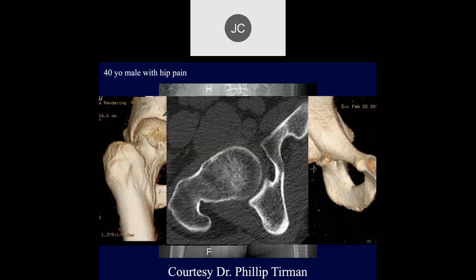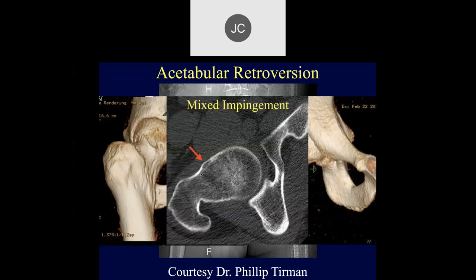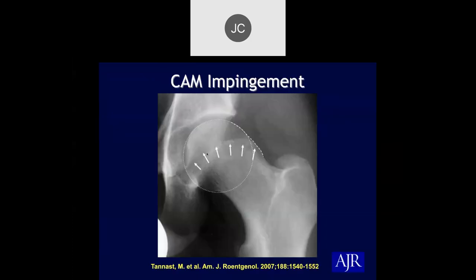On axial images we can see the anterior bump, typical of cam-type morphology. With a superior bump, the configuration of the head changes — it resembles the butt of a pistol with the barrel going inferiorly. This gives what's called the pistol grip deformity — hypertrophic bone superiorly involving the head-neck junction. Many pistol grip deformities can be due to old slipped capital femoral epiphysis, where hypertrophic bone forms at the healing site of the slip, making old SCFE one of the differentials and potential causes of cam-type impingement.